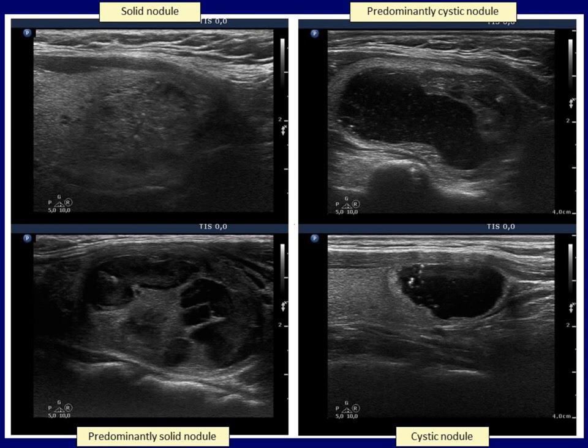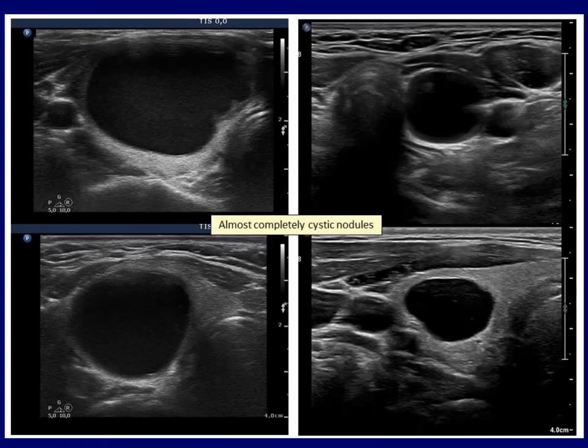In the right cases, the amount of fluid exceeds that of solid portions. In the right upper case, the cystic content is between 50 and 90%, therefore this is a predominantly cystic nodule, while the right lower image is an almost completely cystic nodule because the fluid content is larger than 90%. The distinction between a pure cyst and an almost completely cystic nodule is not always possible and not all guidelines deal with this issue.